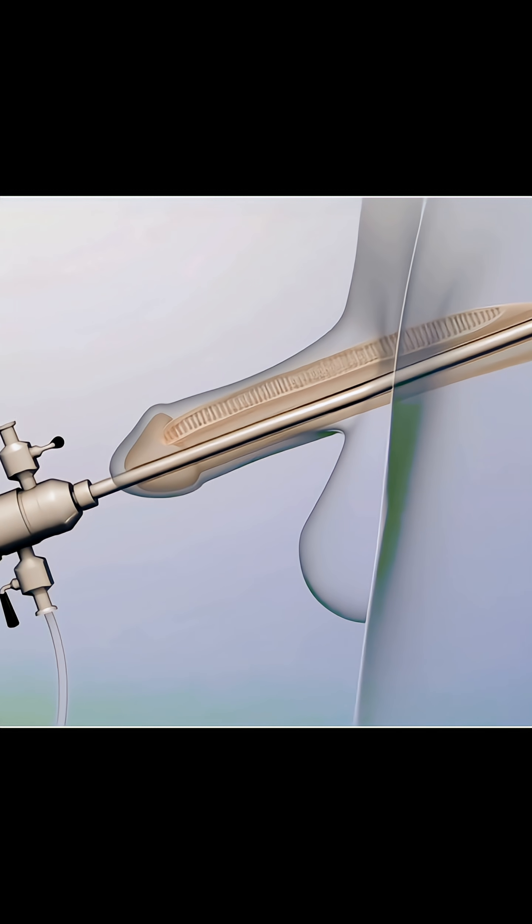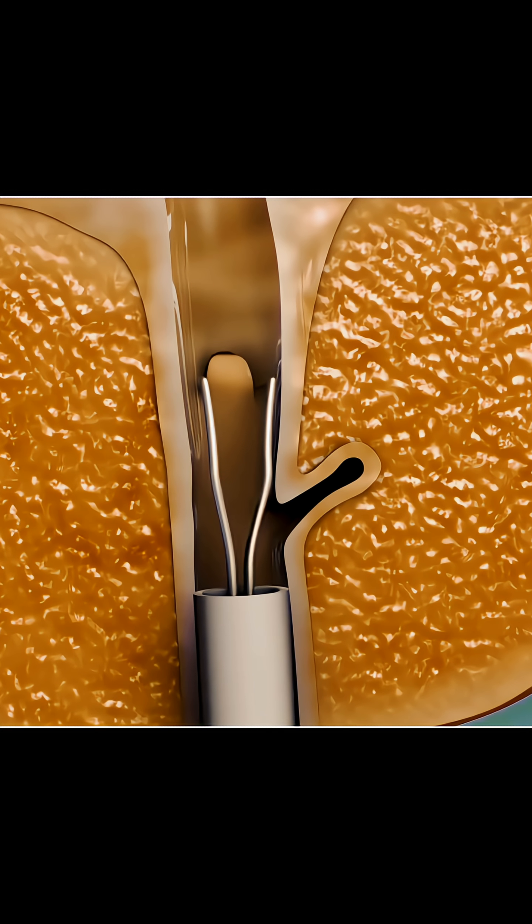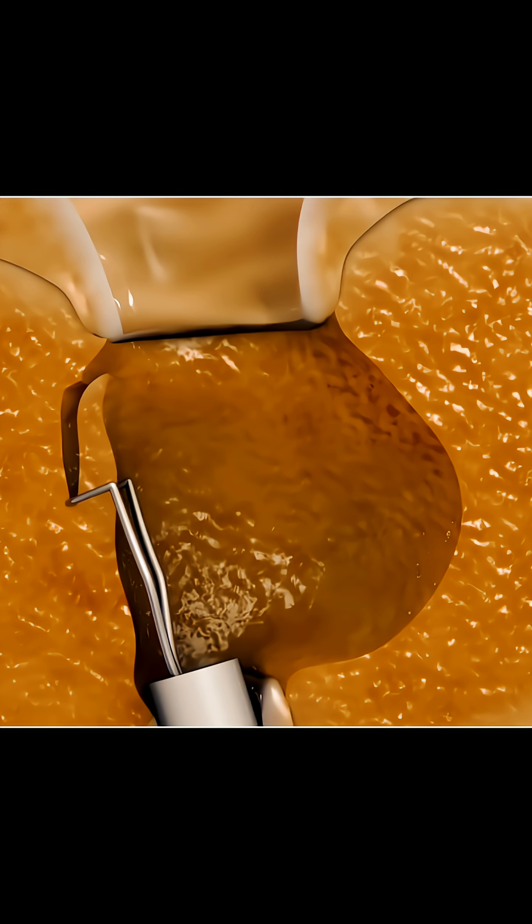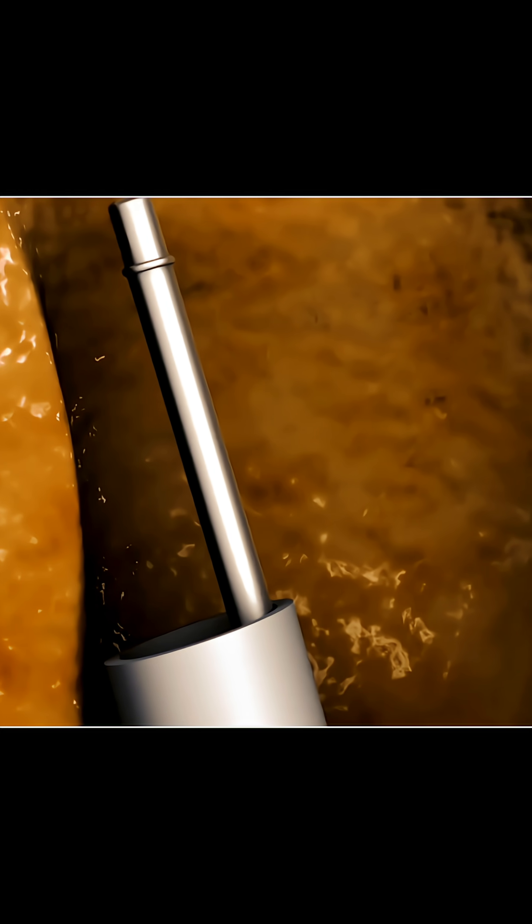Let's talk about how an enlarged prostate gland is treated. During a procedure called transurethral resection of the prostate, or TURP, a surgeon inserts a scope through your urethra to reach the prostate. Using a wire loop, they shave off tissue to widen the urethra.